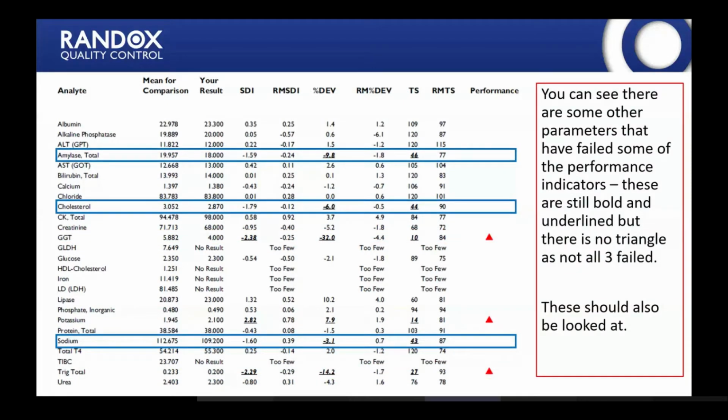So if we look at the other things on this summary page, there are other parameters that have failed on some of the performance indicators, but here you can see the SDI for these ones is less than 2, so it's not highlighted and we don't have a red triangle, but there is a performance issue here. So again, these need to be checked and monitored to see why these have failed on these two performance indicators. So these are the three that are going to be our first priority, and then our next priority will be these other ones that are also bold and underlined.